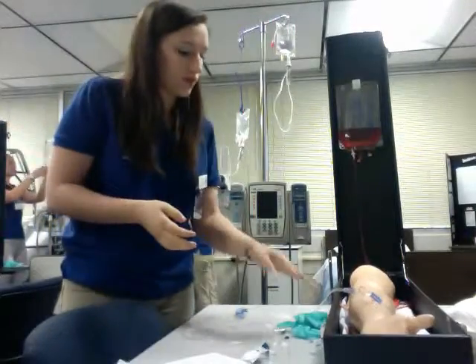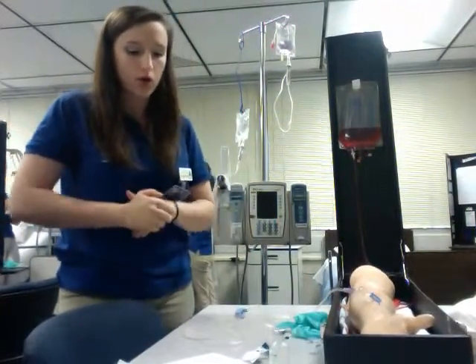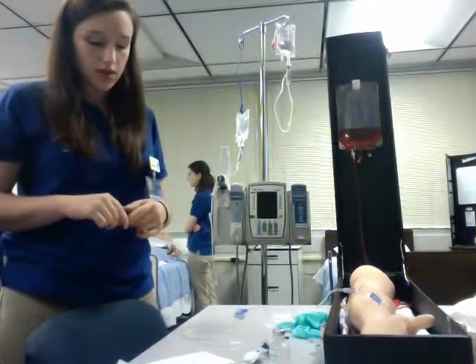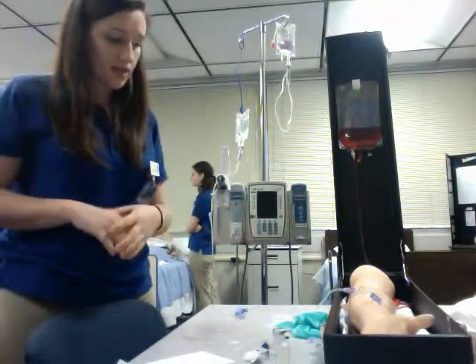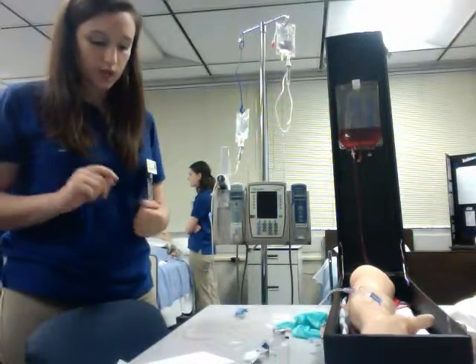I'm going to reassess the IV site, make sure there's no phlebitis or anything. And then I'm going to document in the MAR the medication that was administered, the time, route, and drug and dose that I gave the patient, the condition of the IV site, and it was good. And then I'm going to record the volume of fluid that I used as well as the I&Os.